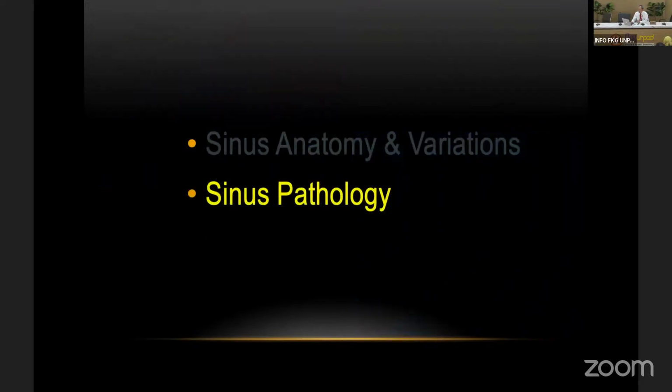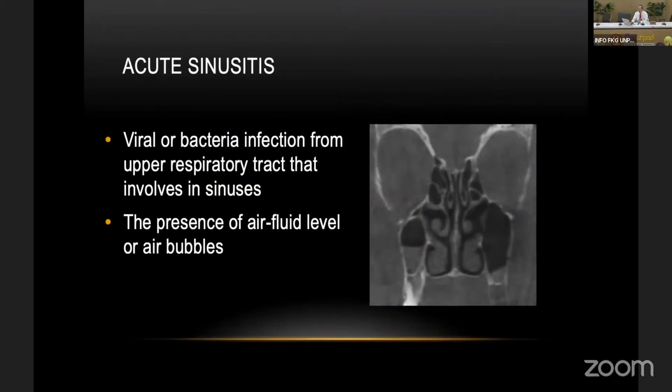So sinus pathology is actually very common when we do dental implants. We have viral infection or bacterial infection. The difference between acute and chronic is that acute sinusitis tends to show an air fluid level, and the patient may have cold or flu symptoms. Sometimes you would see air bubbles here. Those are usually acute sinusitis.